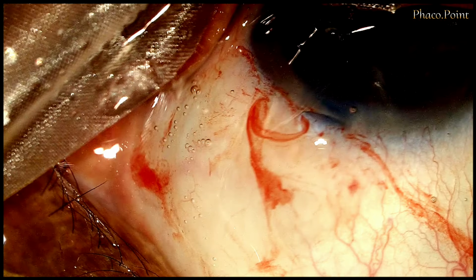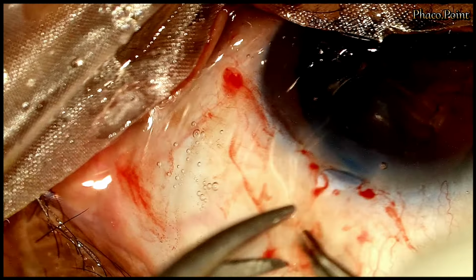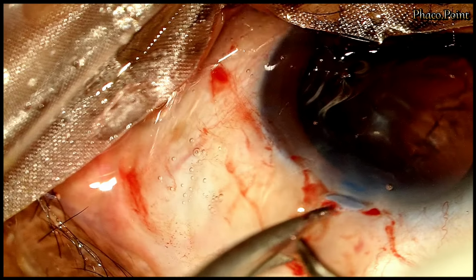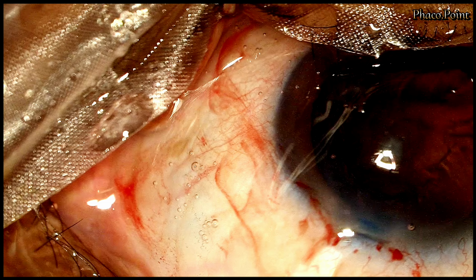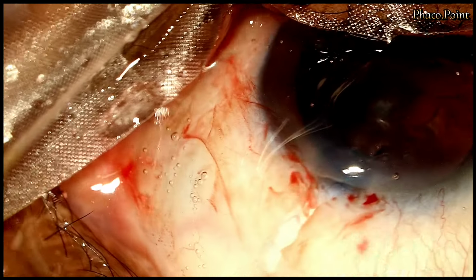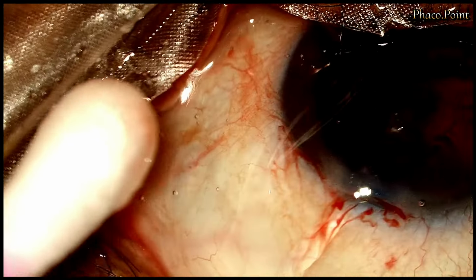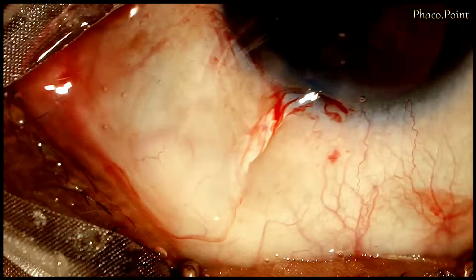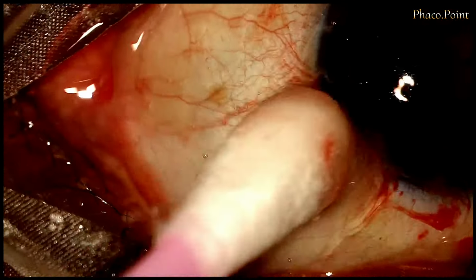The conjunctiva is held with a pair of tooth forceps, and having stabilized it, it is lifted up, and having grasped it well enough, it is cut with the help of a Westcott scissor in a radial fashion. Having cut the conjunctiva as well as the Tenon's, then with the help of a cotton bud, often brought in from both sides, the fluid is milked out through this opening now created in the conjunctiva, resulting in the flattening of the conjunctiva.